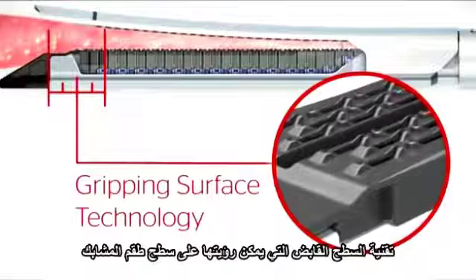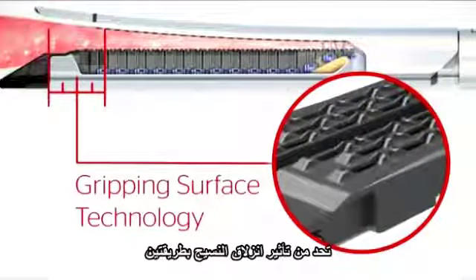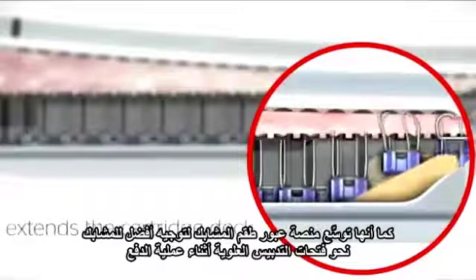The gripping surface technology that can be seen on the reload surface reduces the effects of tissue slippage in two ways. It provides a strong atraumatic grip on tissue during firing to reduce tissue movement, and it extends the cartridge deck to better hold and guide the staples toward the anvil pocket during firing.